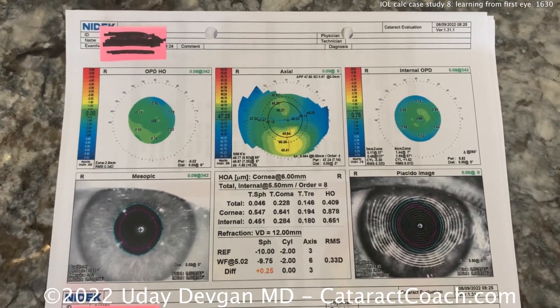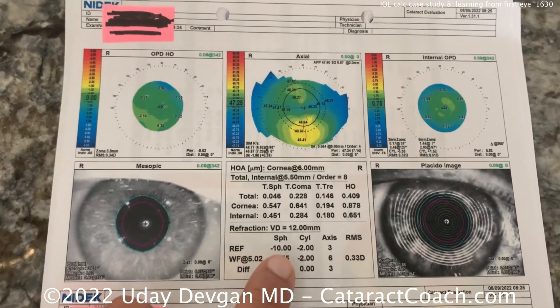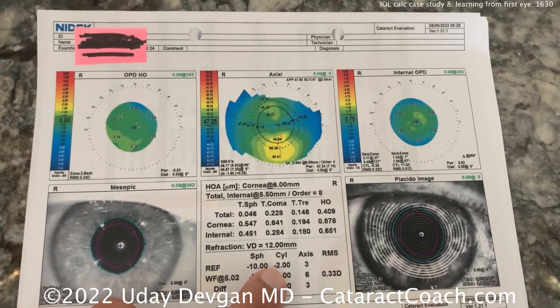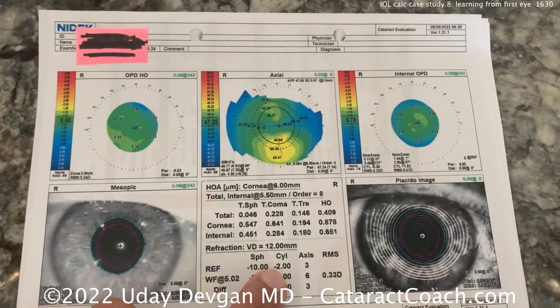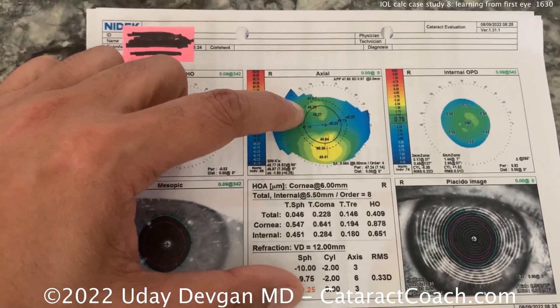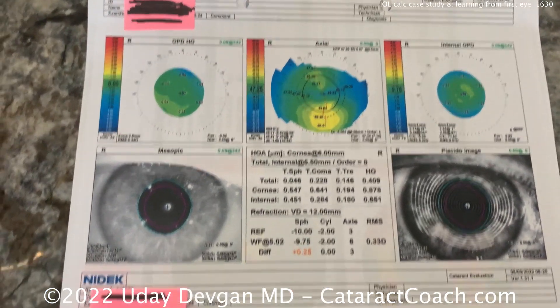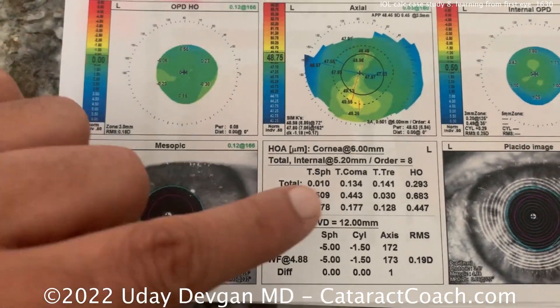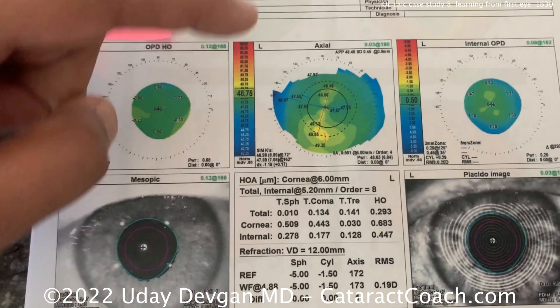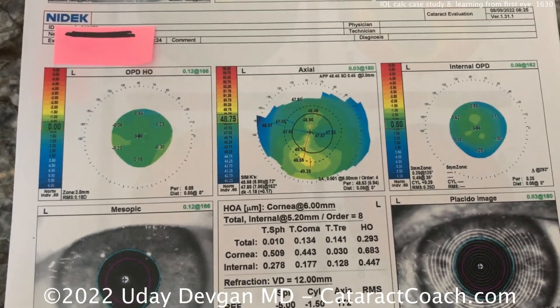Now let's look at this case. The patient is very myopic, about minus ten with two diopters of astigmatism in this right eye, and the topography is not perfectly regular. The left eye is minus five with one and a half of cylinder, and again, a little asymmetry in the topography.